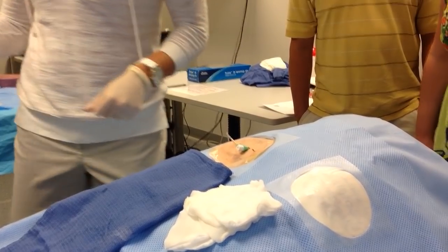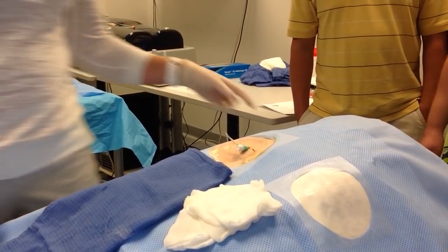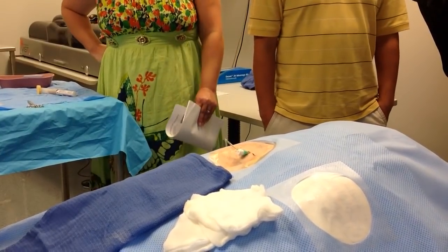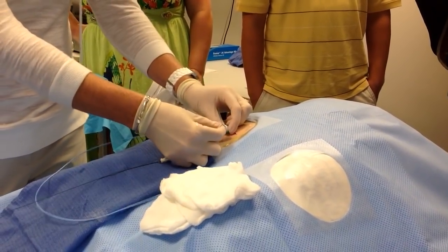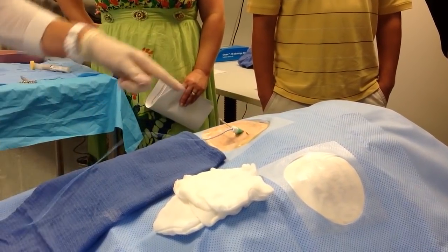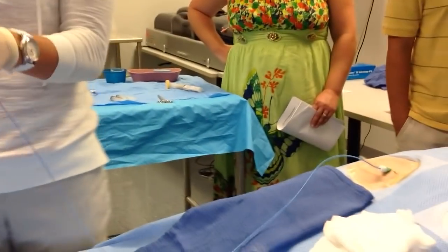Okay? So now we're ready to go with the catheter. You might want to move, just because if I inject, I don't want to get you. So now the physician's going to start with the catheter here. And as soon as they get the catheter in the sheath, you start advancing the guide wire. And this is where we would be on x-ray here.